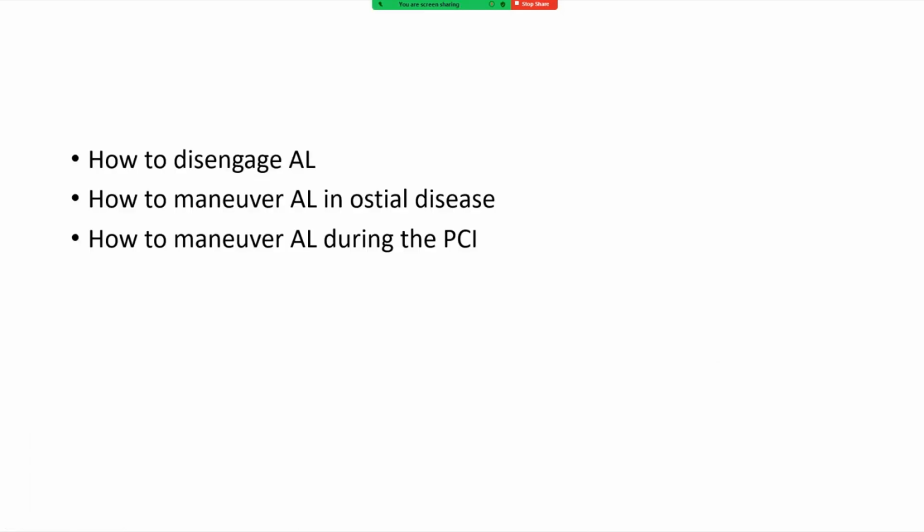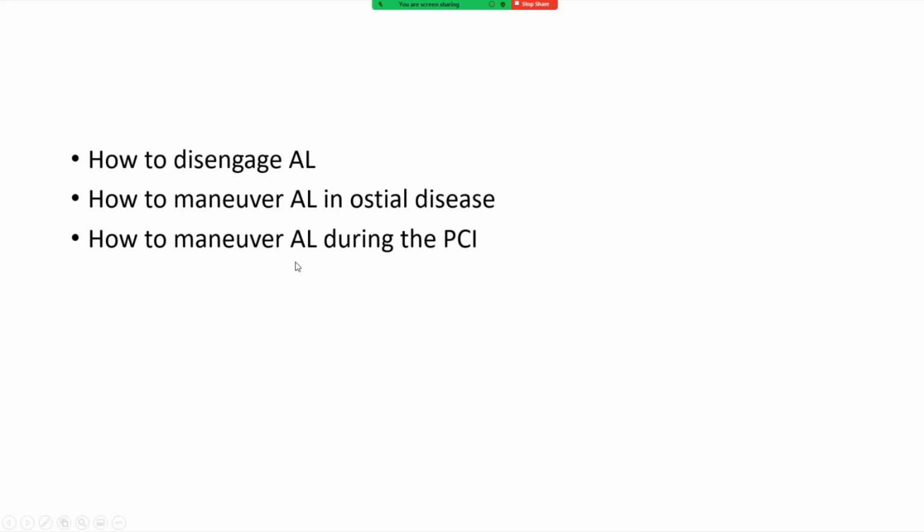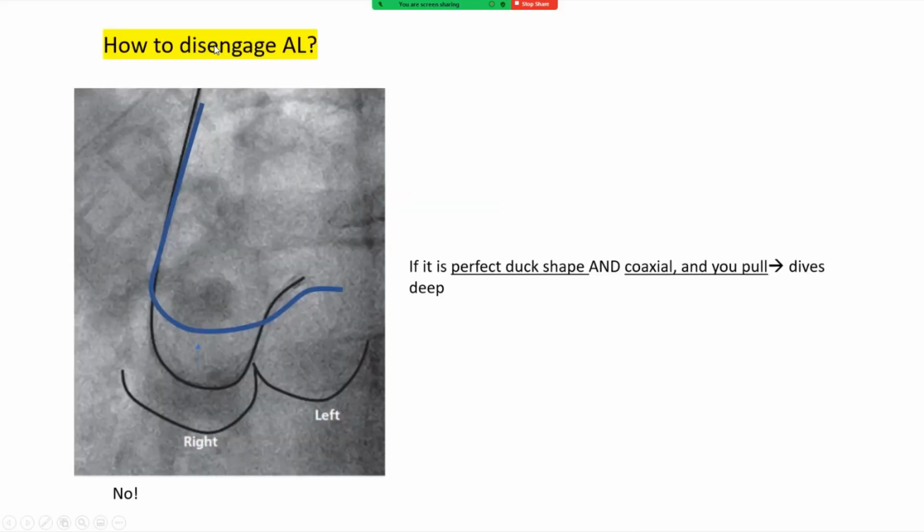Now I explained how to engage Amplatz left. That's not enough. A lot of the complications of Amplatz left happen as you're trying to disengage it, and especially as you're maneuvering during PCI. This is where you can get that long tip to dissect the right coronary artery. So I will describe first how to disengage the Amplatz left.